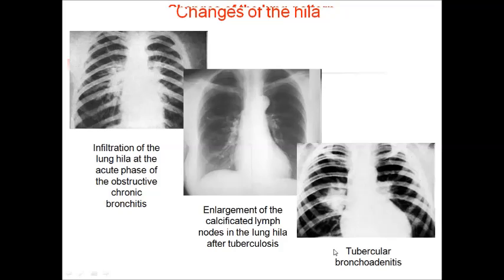All these pathologies make the hilum more huge, enlarged on plain X-ray films.